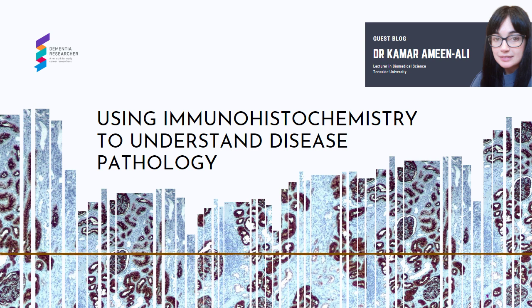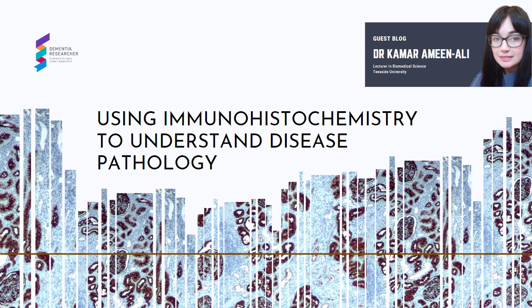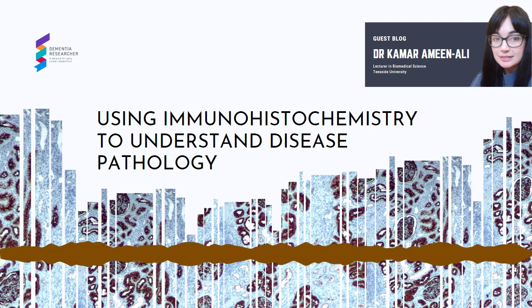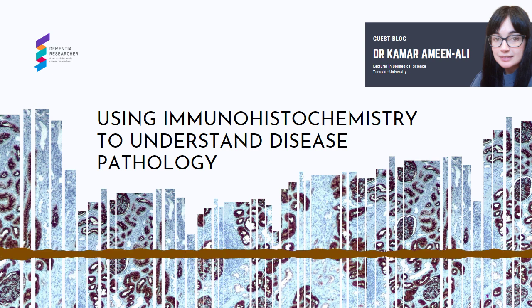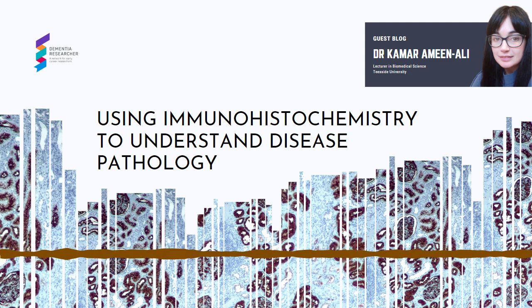This visualization is possible because when the primary antibody binds to the antigen in the tissue, a secondary antibody is then used to bind to the primary antibody, which can be conjugated to an enzyme that produces a colour following a reaction. This is known as chromogenic immunohistochemistry. The colour produced depends on the chromogen used, but the one most commonly used will produce positive brown staining. If the secondary antibody is conjugated to a fluorophore, you will get a very cool and colourful immunofluorescent staining.